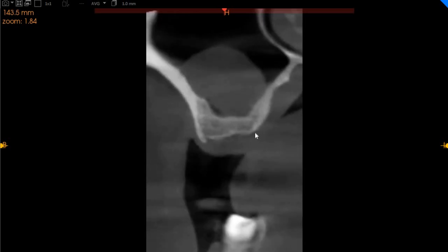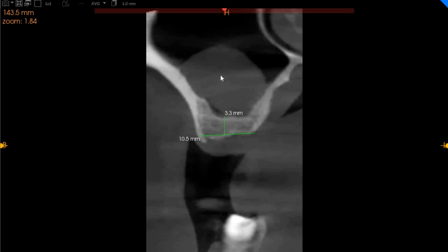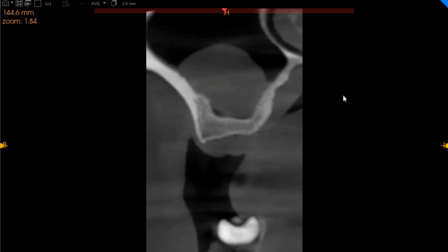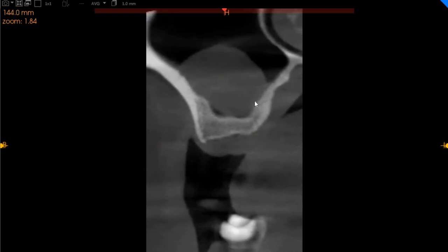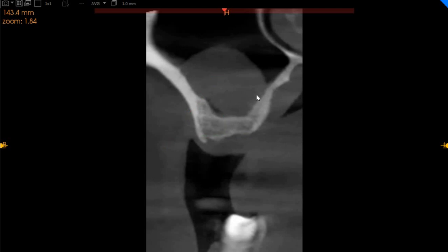And in the region of the upper left six, we've got again very limited bone — 10 millimeters of width, but only 3 millimeters of height. Also to be noted, we've got sinusitis in this region on the upper left. So a sinus lift should be done very carefully. Unless the sinusitis is cleared, sinus lift should not be attempted.